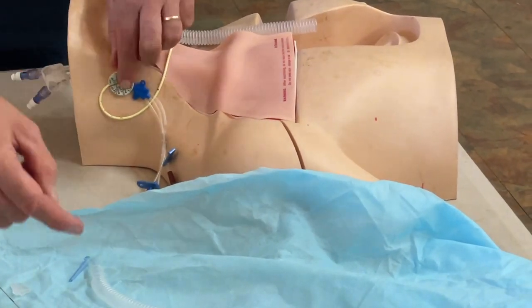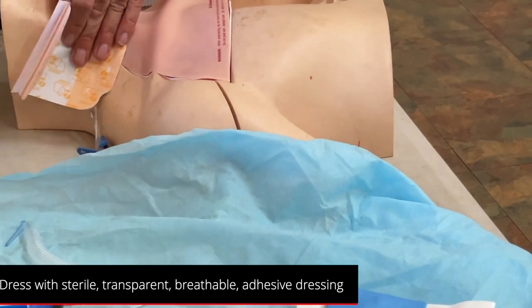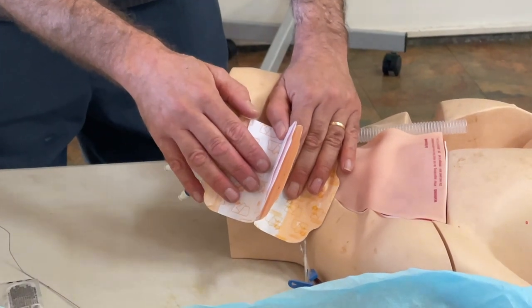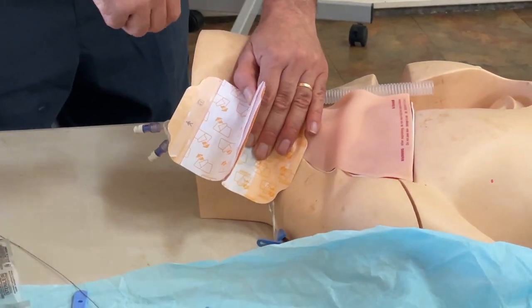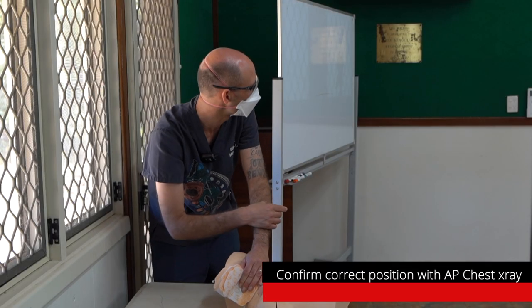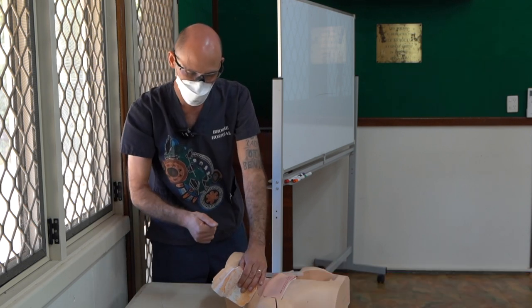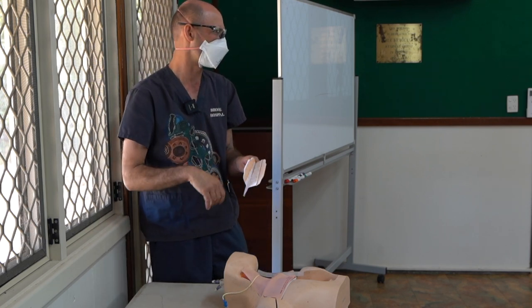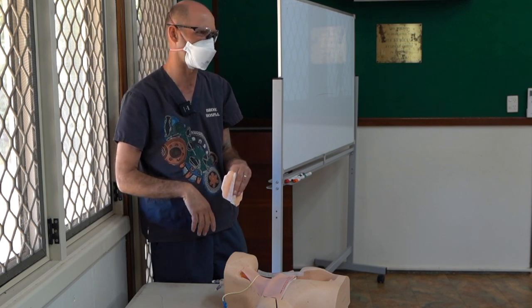Suture that. Once that's sutured, I'll ask help from the nurses — then I do what I call a sandwich dressing. I'll put a sandwich dressing on and then Tegaderm around the outside, fixing it so you can always see the insertion site. Can I just use it now? X-ray first — it means I've been really careful to confirm I am where I think I am. At any time the places you'll know you're wrong: if you can't feed something — it gets stuck — just stop. If you can't feed the wire or the catheter, stop and start again because it's probably not in the right place.